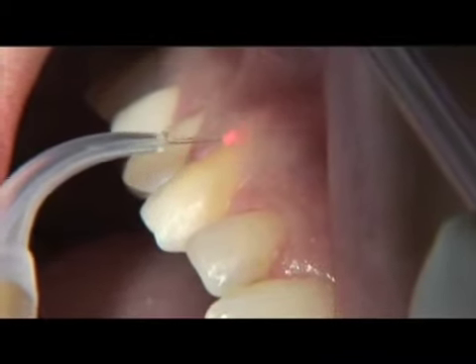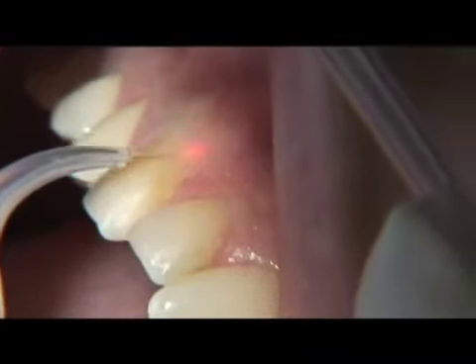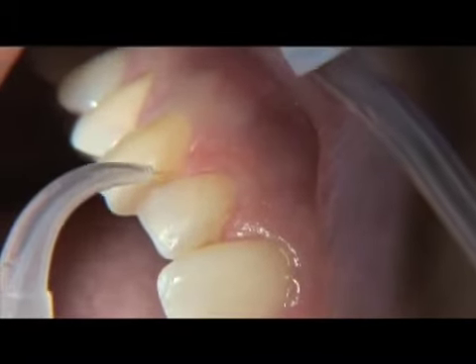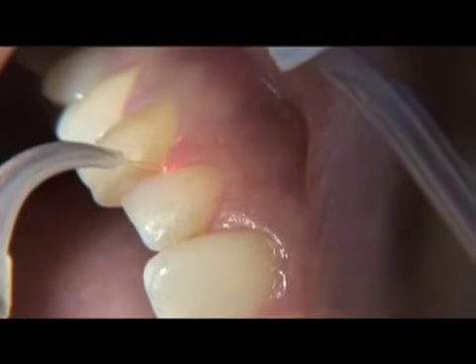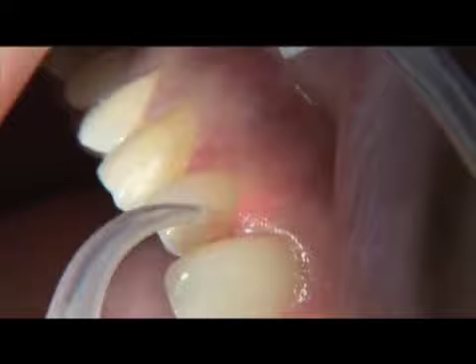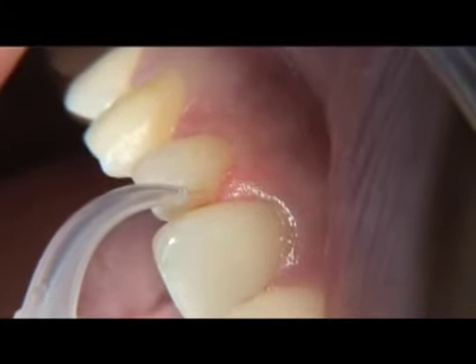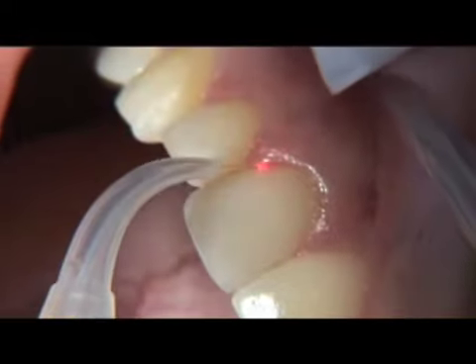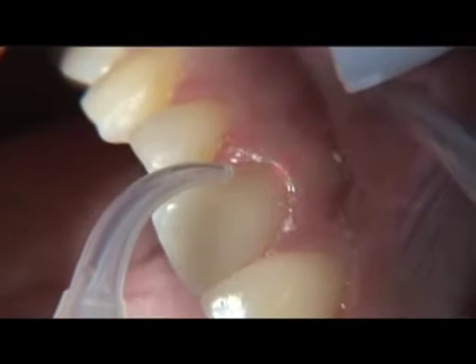Remember, the clinician, assistant, and patient must always wear wavelength-specific safety glasses during laser procedures. Start with a setting of 1.0 watts. Use the minimum amount of power required to reach your treatment objectives. Start with the lower power settings for the procedure that you are performing and increase power only as needed.